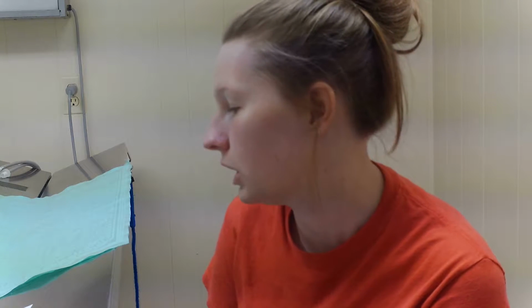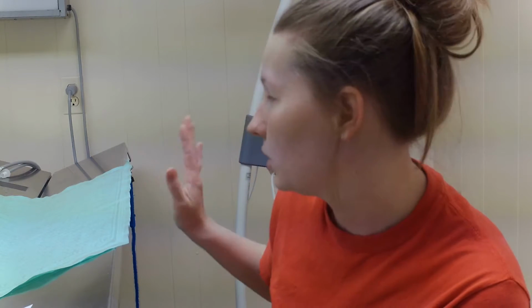But as far as readings and monitoring devices, I had to return all that equipment that we had borrowed to the neighboring veterinary office. Essentially, what you want to know is that the pulse oximeter is reading everything properly. The oxygen saturated hemoglobin means that the oxygen the animal is breathing in is actually oxygenating the blood properly, and the capnograph measures the output of the carbon dioxide of the patient.